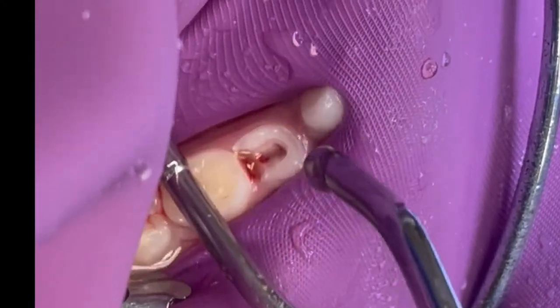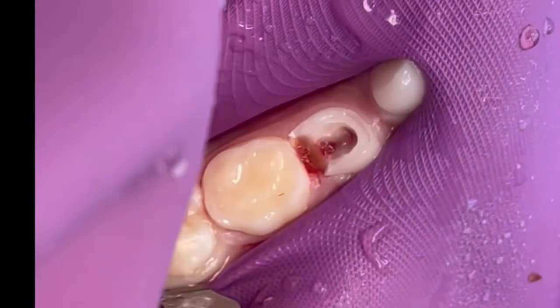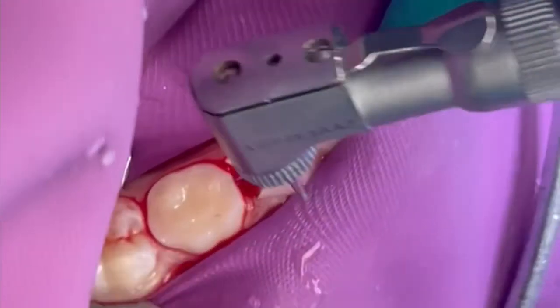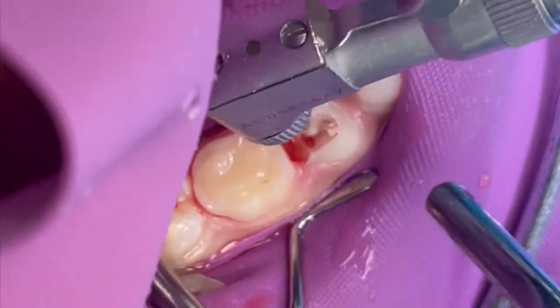So we're going to rinse this and take a look at what the pulp looks like. If you notice, we have most of the pulp tissue. I had a little bit of decay left on the distal aspect. The mesial and distal pulp tissues are pretty well removed. I'm going to take a smaller slow-speed burr and remove some of the distal tissue — I can clearly see the outline on the pulp and the floor. So our next step is going in with a smaller slow-speed round burr, and you can appreciate that's what we're doing here.